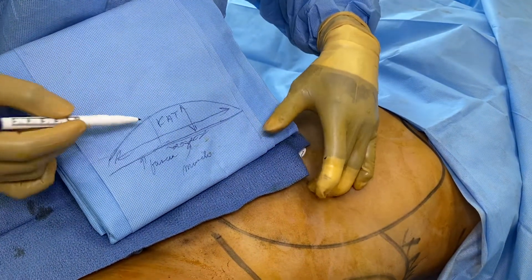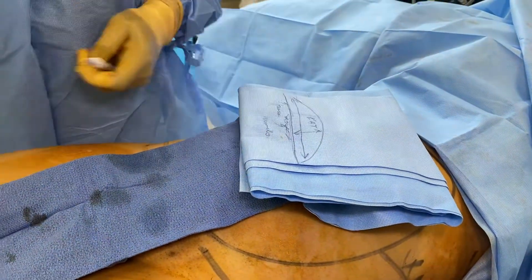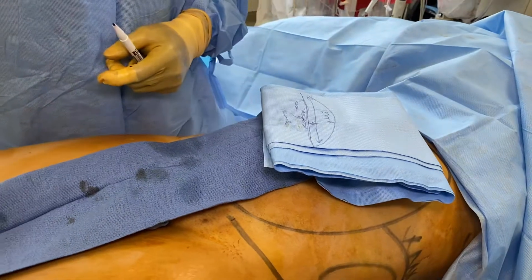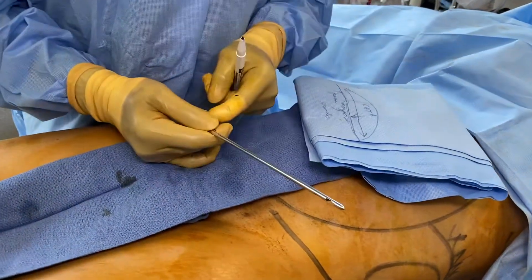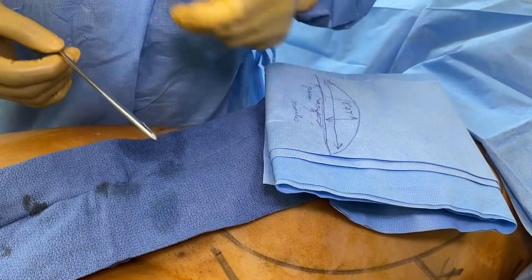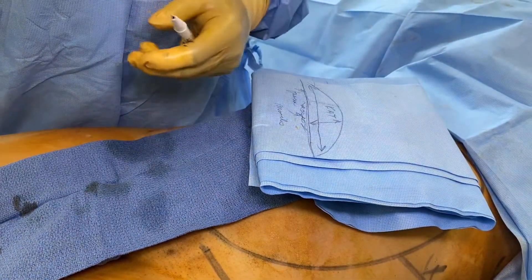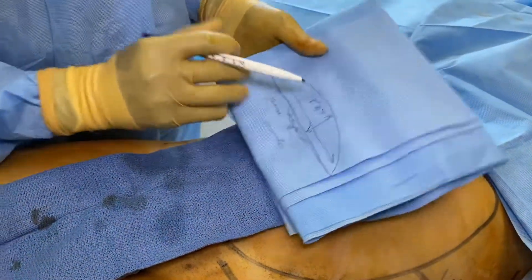How liposuction works is this: we take a cannula — the cannula is hollow inside. We use what we call a power-assisted liposuction unit to help take the work off of the surgeon, because liposuction is the most strenuous cosmetic surgical procedure.